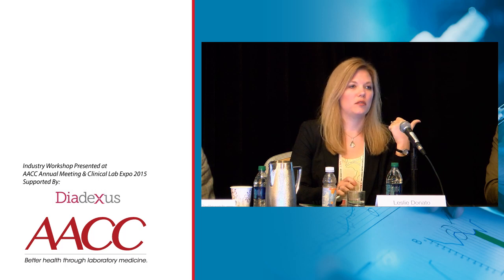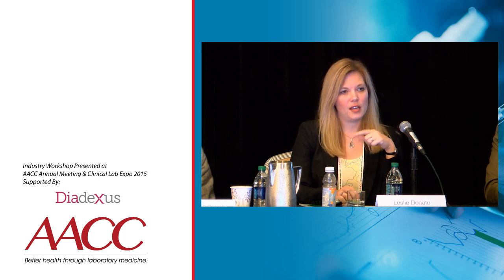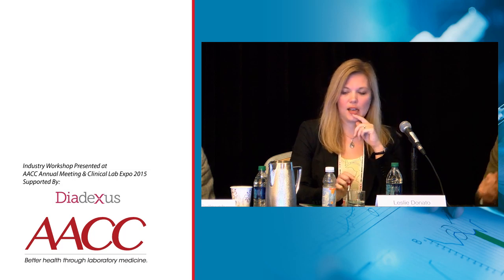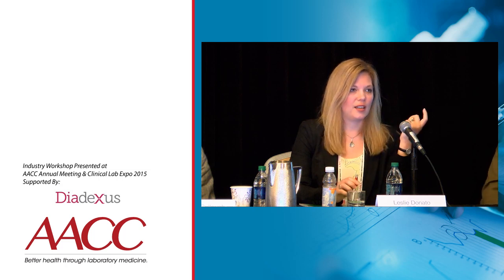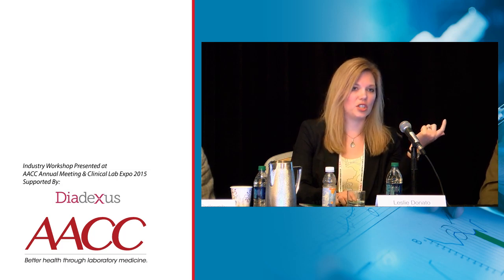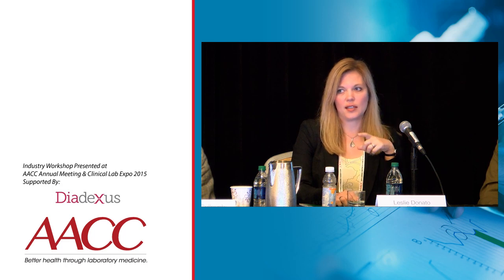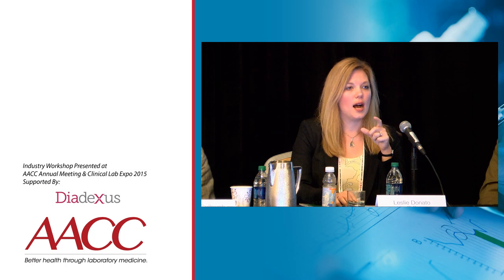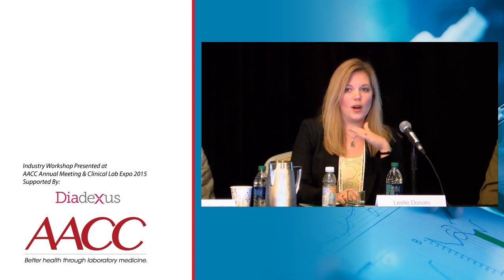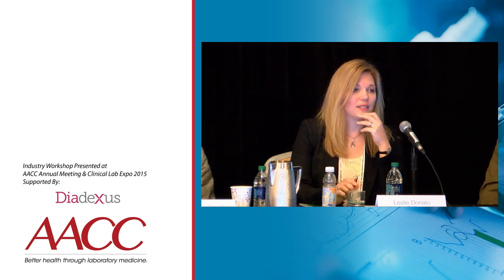We were involved in evaluating the assay in a pre-FDA format for several years before the FDA approved it. We actually had a stored sample bank that we tested on one of our first lots of pre-FDA approved reagent. We retested those same exact samples after the FDA approval. The samples were stored for 3 years. We got exactly the same results. So it's really a very analytically robust assay.